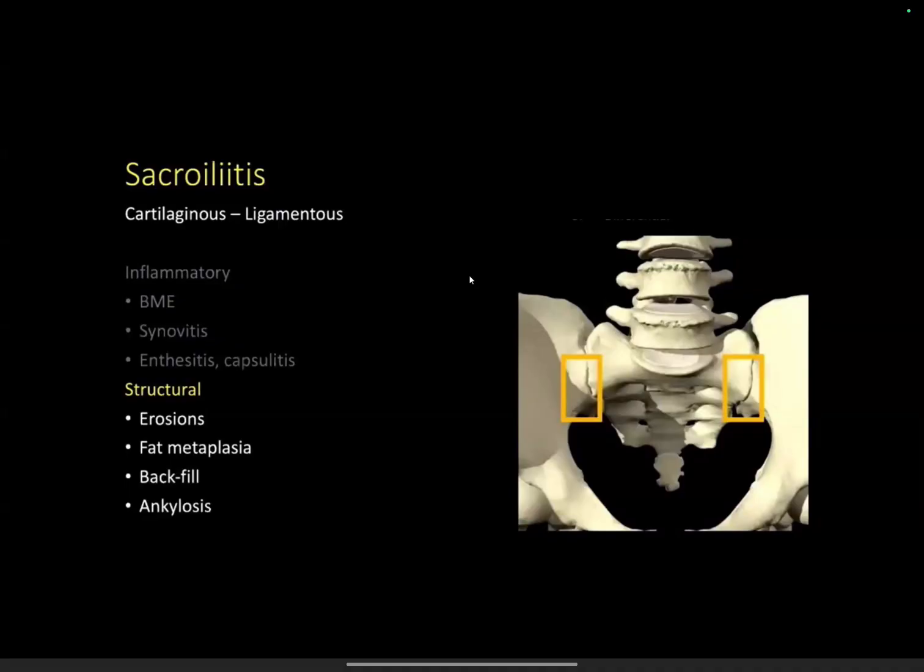Okay, then the next question is, if osteitis condensans ilii is a chronic subacute disease, why does it present with pain and what is the cause of pain? It does not always present with pain, first of all. It can be an incidental finding in most cases. Maybe you can see it more commonly on CT abdomen than on MRI. You'll appreciate it more when it's very sharply only along the iliac aspect and the patient came for something totally different pathology.